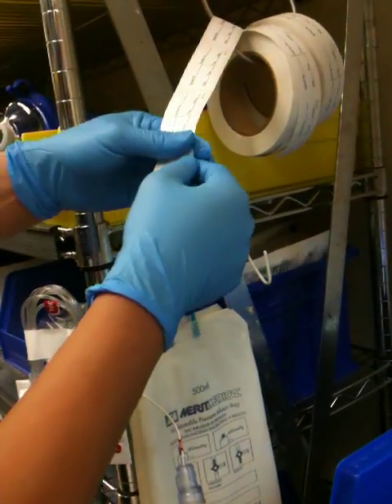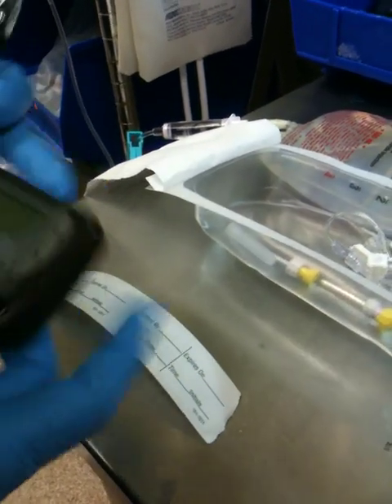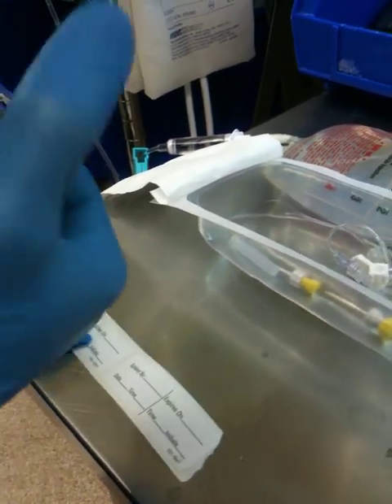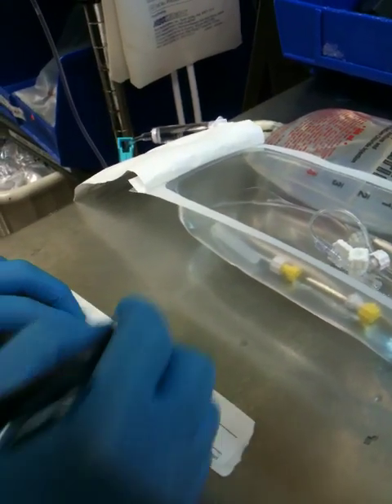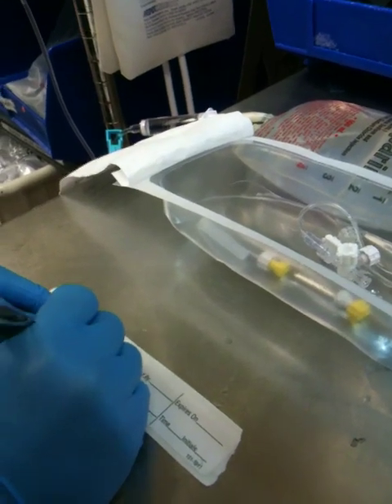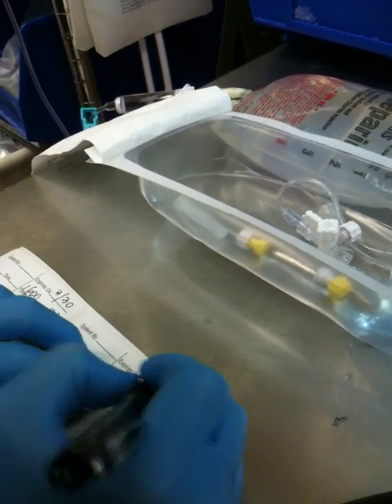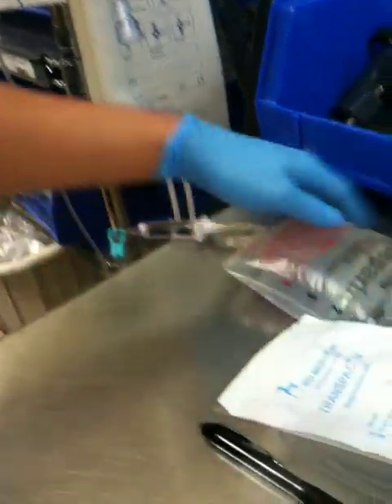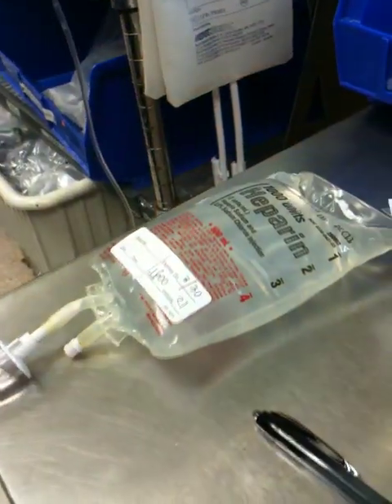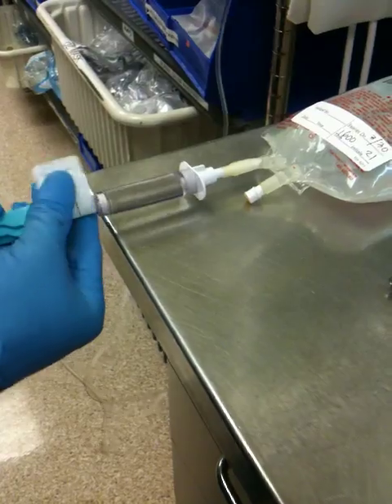After you spike it, you've got to take your labels from here. Take two labels. My time is 1600 — expires tomorrow, 3/30, 24 hours from now, because today is the 29th. Expires at 1600. My initials — we use our number. Do the same thing here. Take one label, put it on the bottom of the bag. Take the other label, put it on the bottom of the chamber.